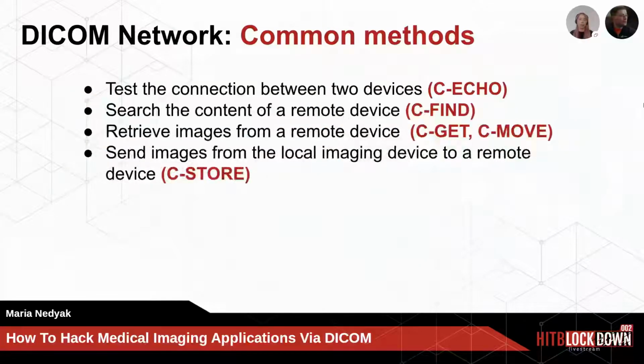There are common methods of the DICOM protocol. The echo command is used to test the connection between two devices. The find method is used to search for a scan. The get and move methods are used to retrieve images from the DICOM server. And the store method is used to store an image on the remote DICOM server.